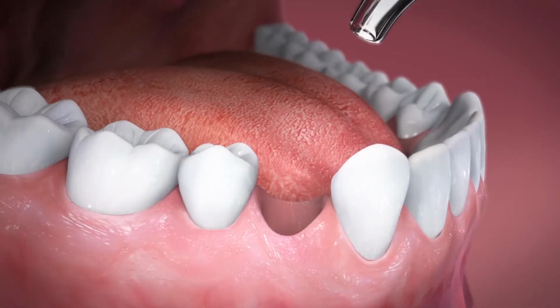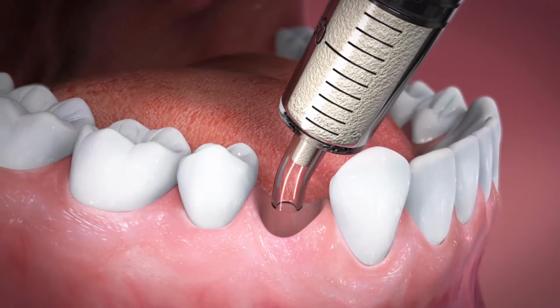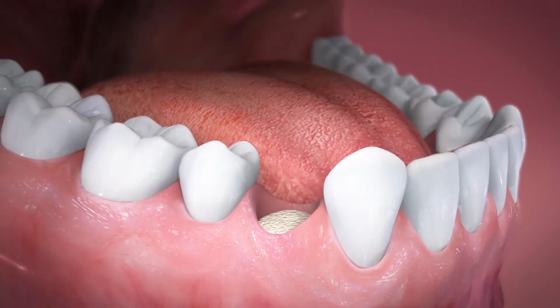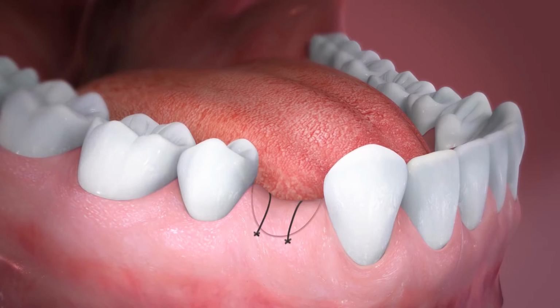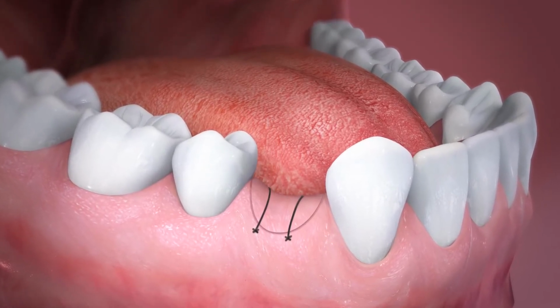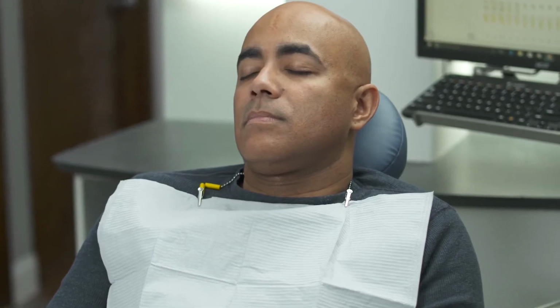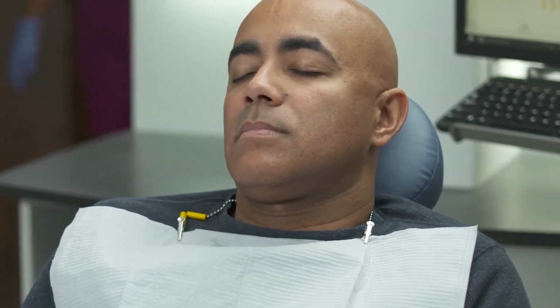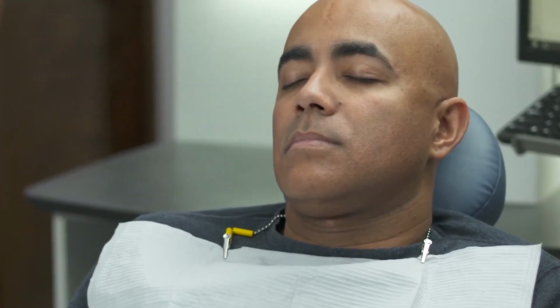Once the tooth is removed, the extraction site may be filled with processed bone grafting material to minimize the shrinkage of surrounding bone tissue. This allows you the option to replace the tooth with a dental implant if you so desire. The extraction site is then sutured to prevent bleeding and aid healing. You won't feel any of this because you will be given a local anesthetic, and if you would like, a sedative to help you relax.